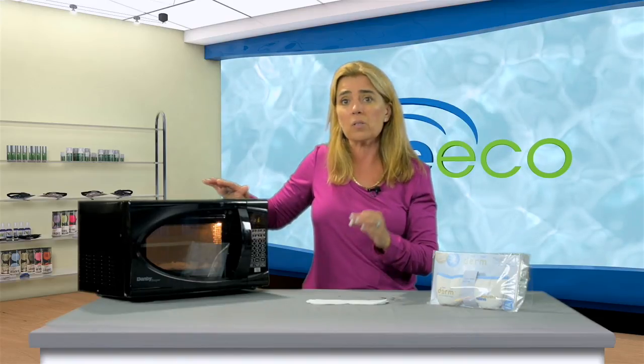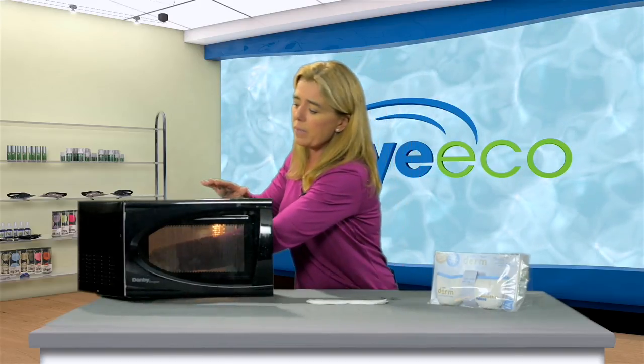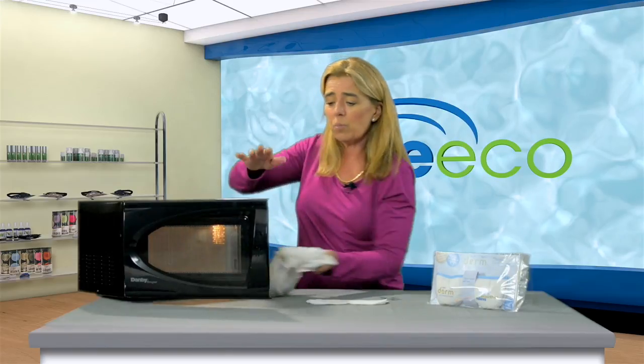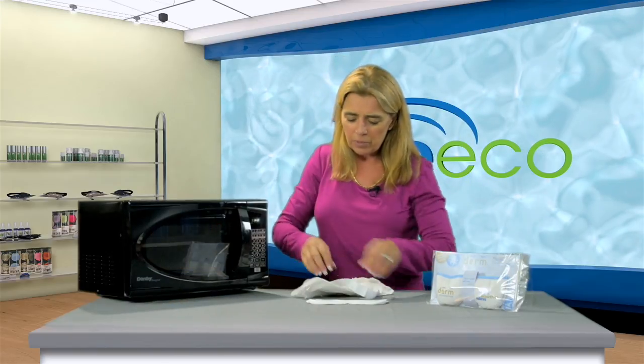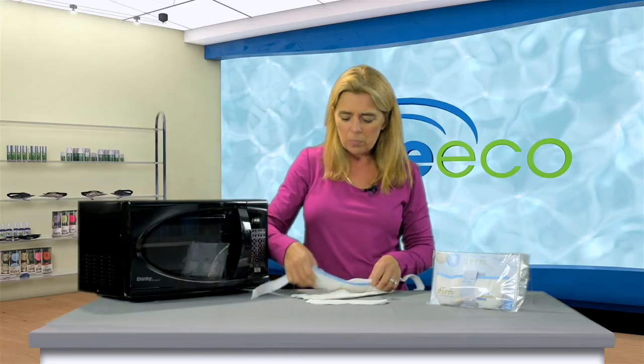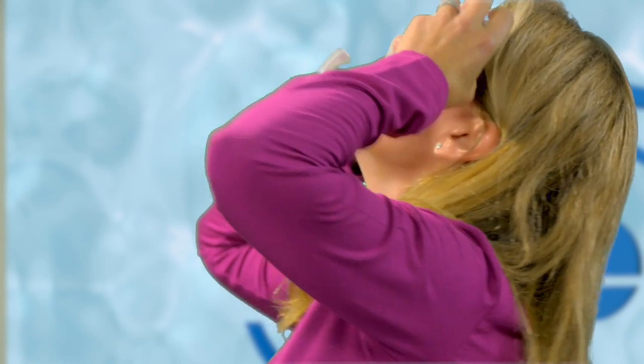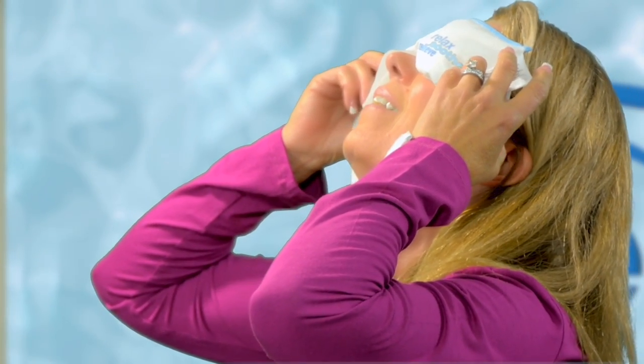The nice thing about the Derm Mask is it's also very easy to clean, reusable, and all natural, so you can get multiple uses out of it. When the 20 seconds is up, find a nice comfortable place to lay down. Simply take the mask and use it with or without the strap — just put it over your lids, and voila. Oh, that's good.